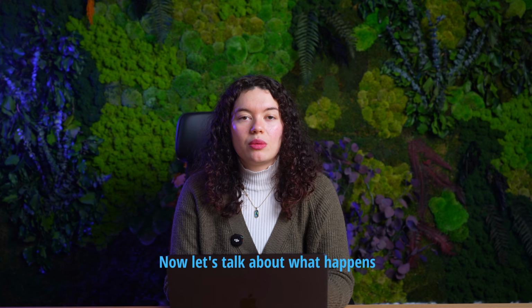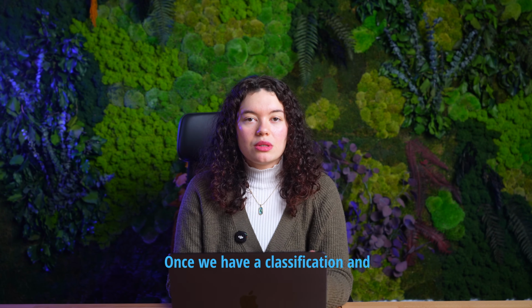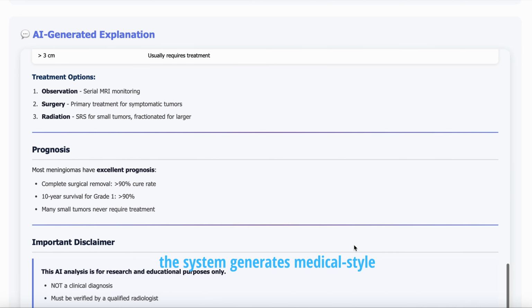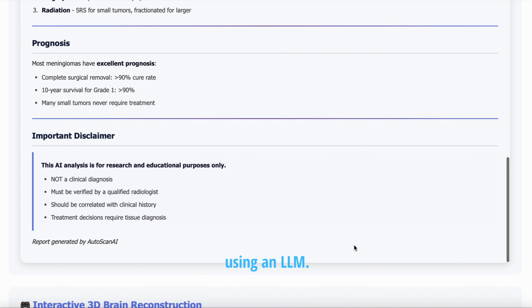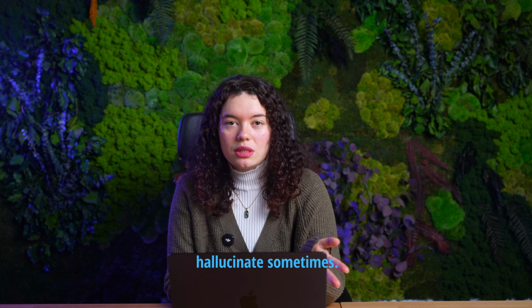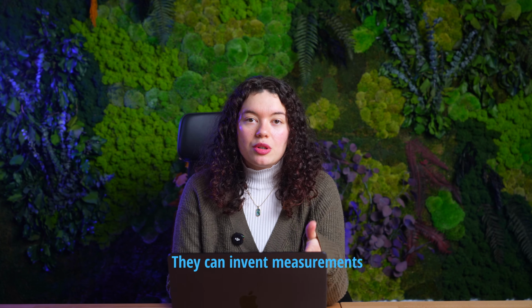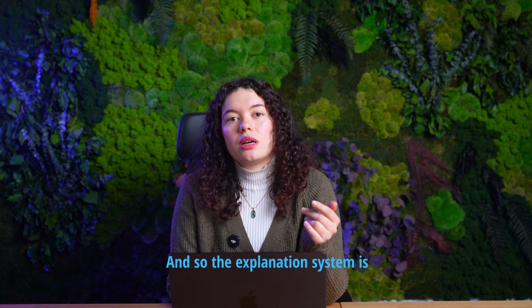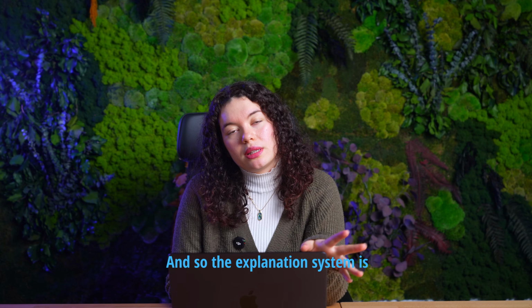Now let's talk about what happens after detection. Once we have a classification and a heat map, the system generates a medical-style explanation using an LLM. And this is a bit risky because language models hallucinate sometimes. They can invent measurements and sound authoritative about things they don't know, and so the explanation system is tightly constrained.